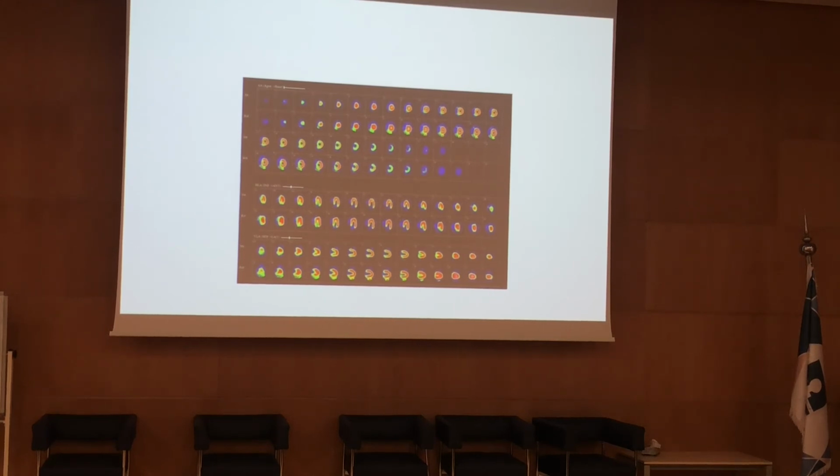See, like a donut shape. So we cut it from base to the apex. So we cut the heart. Here is the base, going down to the apex. This is the apex. And this is the septal wall, lateral wall, the anterior wall, and the inferior wall. We see if there is any perfusion defect, and compared to the rest, this is stress and this is rest.